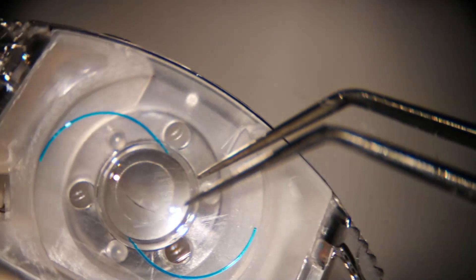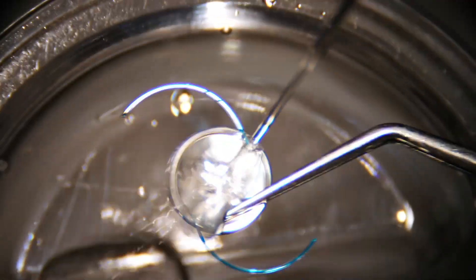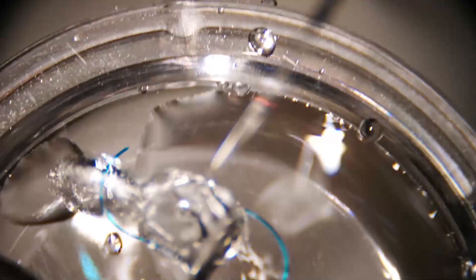This is the Sensar multi-piece lens from Johnson and Johnson. Hold the lens — do not touch the center of the optic, always hold it at the haptic. Now wash the lens nicely.